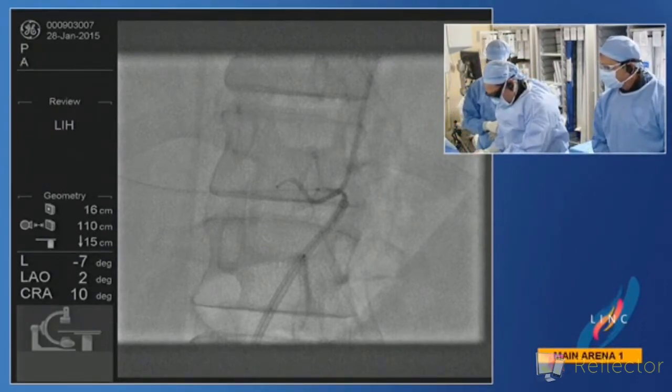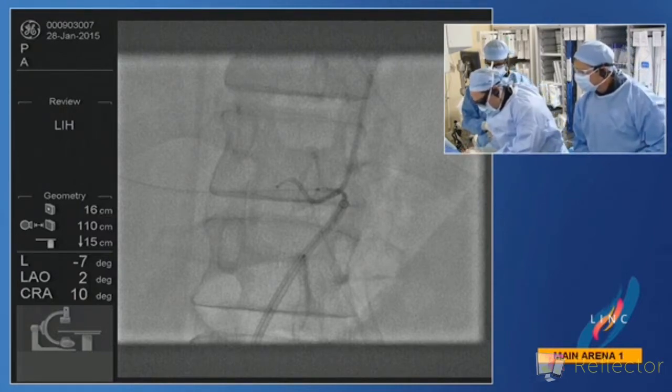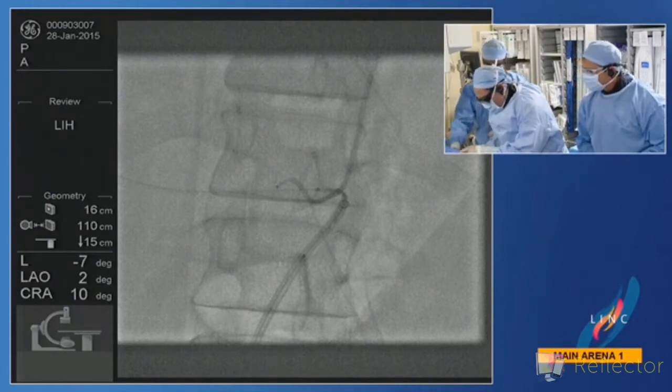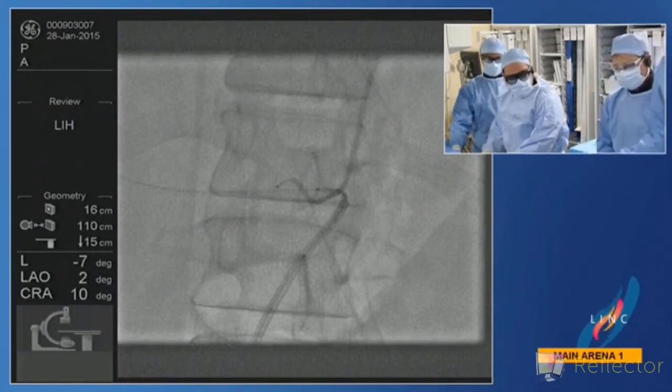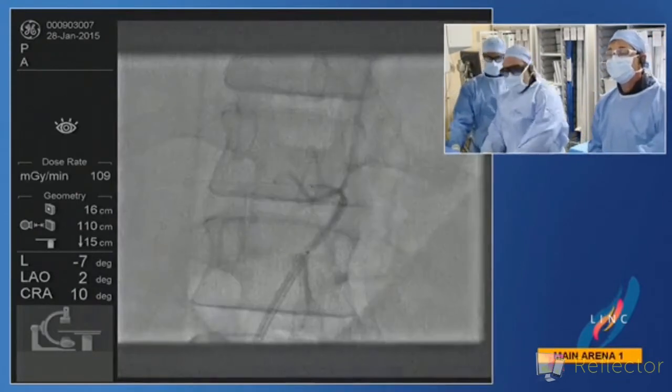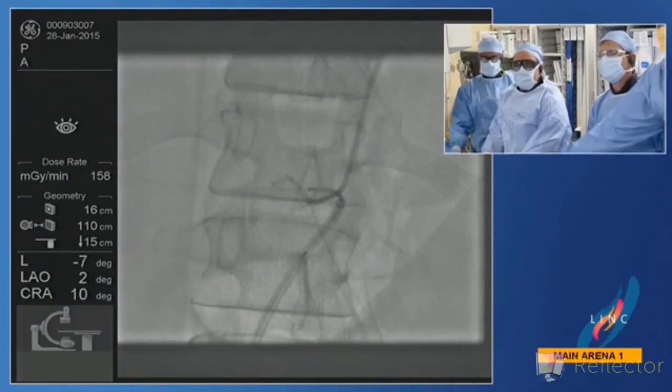And then these guys can take all the time they need to go ahead and coil that splenic. So I'm hoping that we can get you a picture with the stent in place in the next couple of minutes. Just got to hang this splenic. Yeah, take your time. We're seeing exactly what's happening and we know what the result's going to be when you're done. It's going to look beautiful. So take your time and just show us the technique and talk to us.